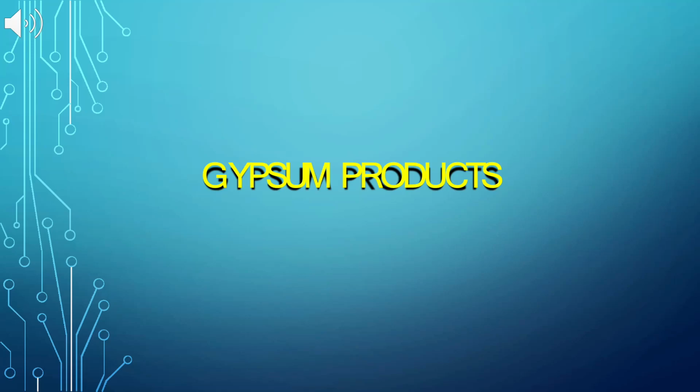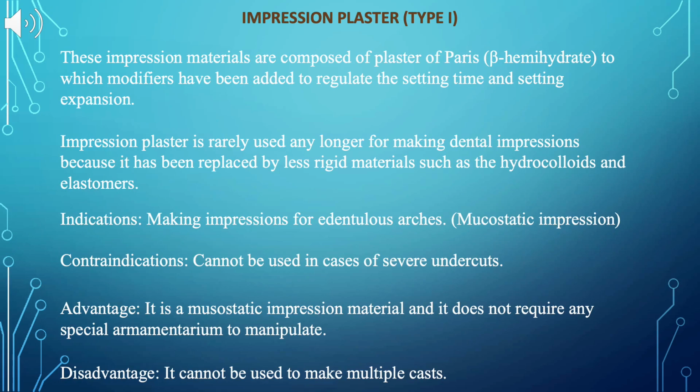Gypsum products. Impression plaster, type 1. These impression materials are composed of plaster of Paris, beta hemihydrate, to which modifiers have been added to regulate the setting time and setting expansion.